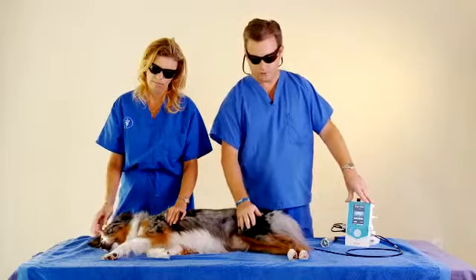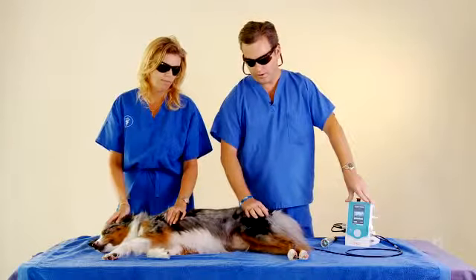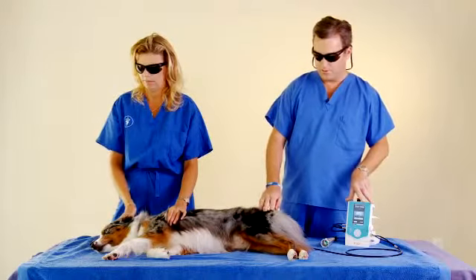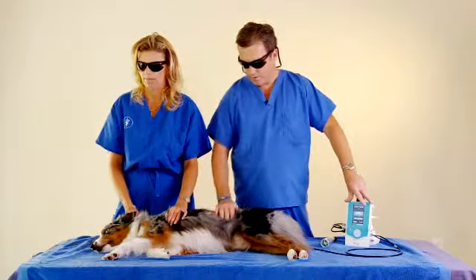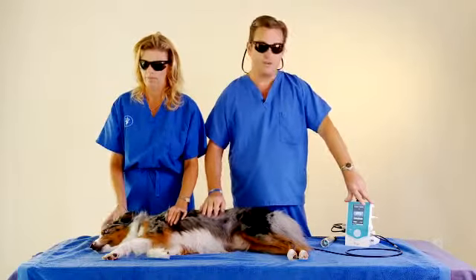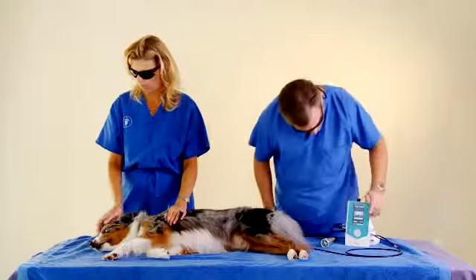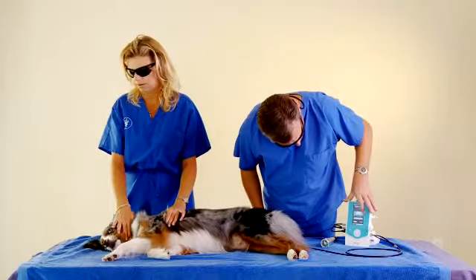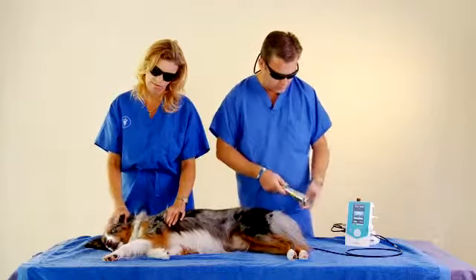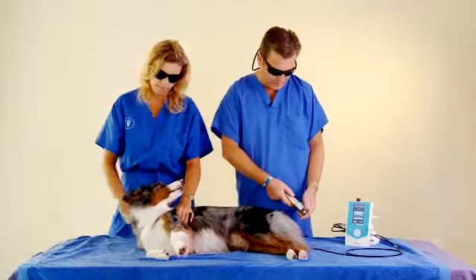Or you can also assume that he's had a cruciate surgery that you're trying to get to heal better, or a tibial tuberosity advancement surgery that you're also trying to get the bone cells to lay down more efficiently. So again, depending on what you're treating, it can take about 2 to 7 minutes of actual laser time with the patient. At this point, Joker is about the average dog size. We're going to do a stifle, but you can turn it up to, let's say, 3.5, depending on your clinical judgment. The stifle's a pretty small joint on this animal, so I'll go down to about a 25 millimeter spot size.